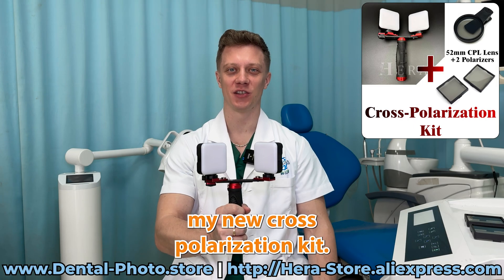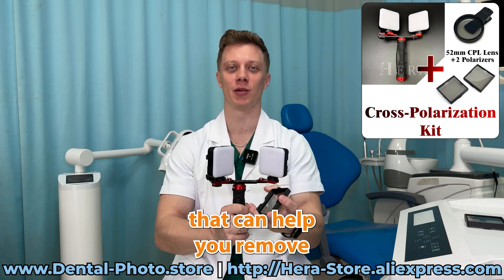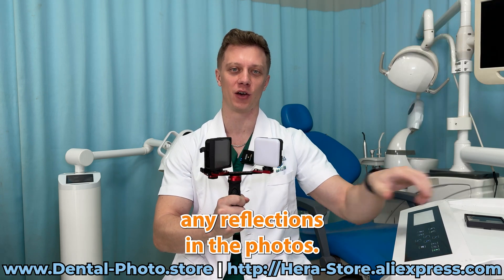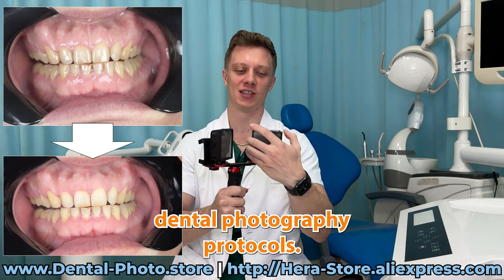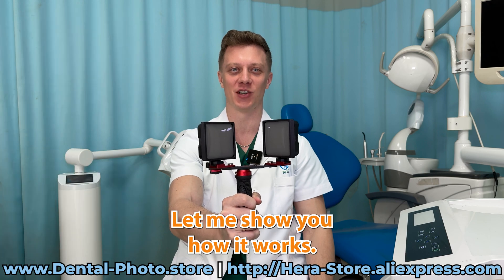The next option is my new cross-polarization kit. It has the newest accessories that can help you remove any reflections in the photos, so it fits for any dental photography protocols. You're gonna love the results. Let me show you how it works.